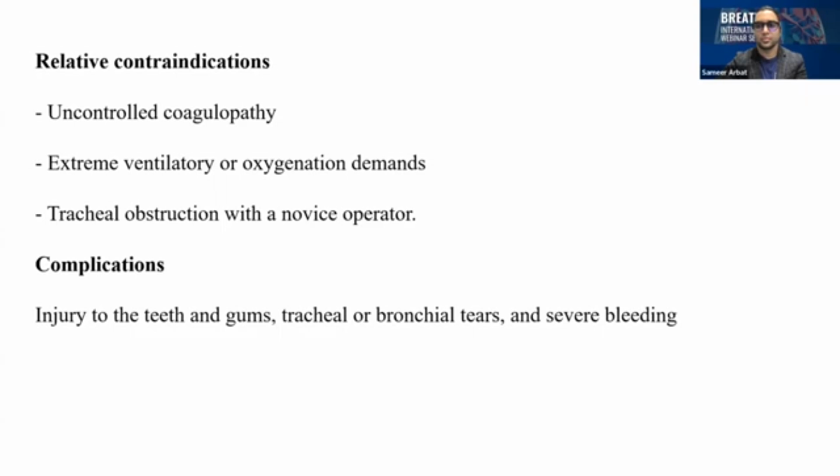But having said that, as you start doing it, you will realize that it's a very, very simple procedure, and all that it requires is a certain orientation to the anatomy of the upper airway, as well as good observation skills, and you need to have enough practice before you start doing it on your own.